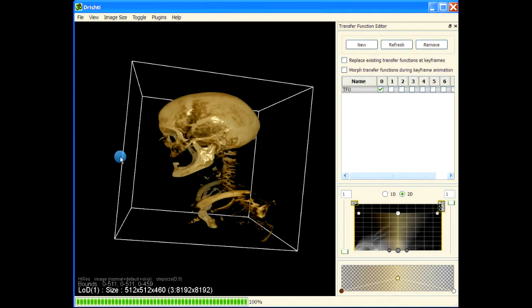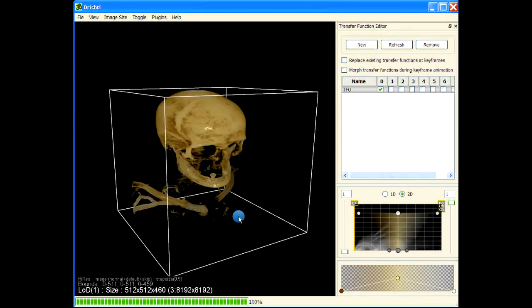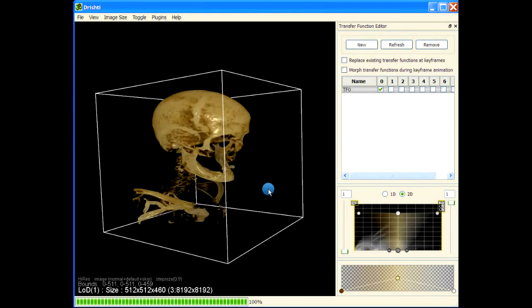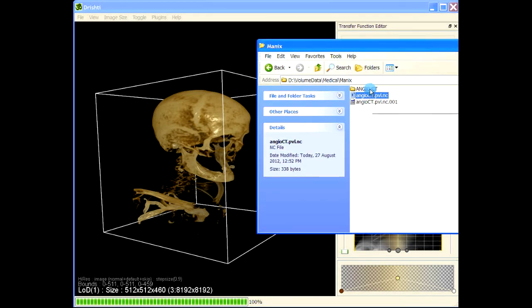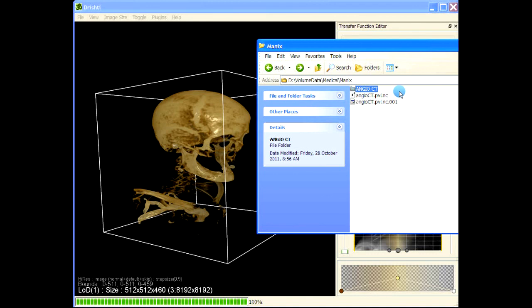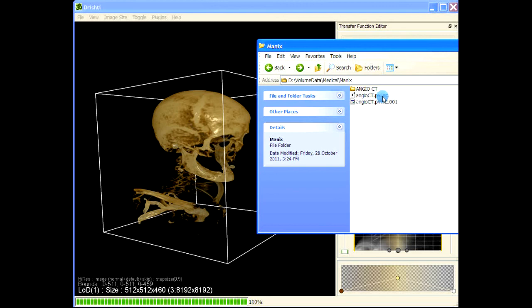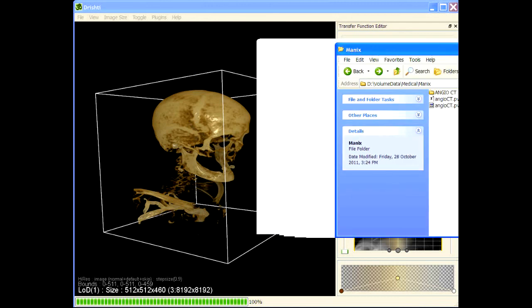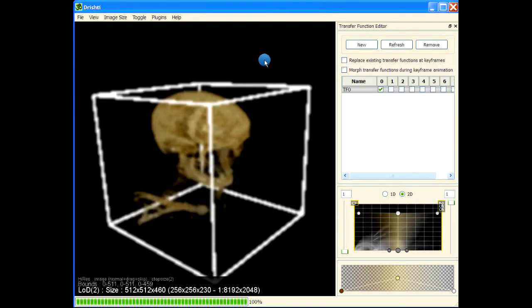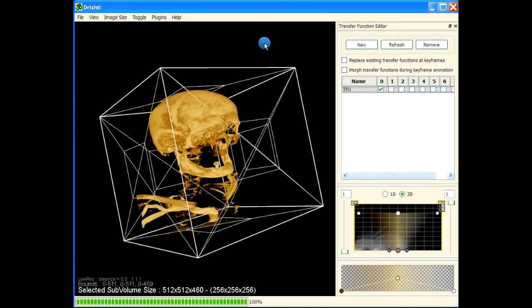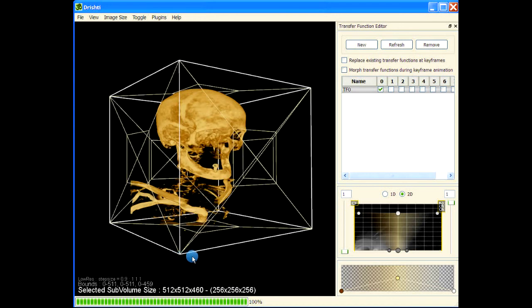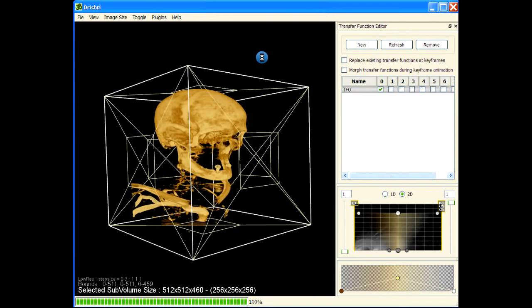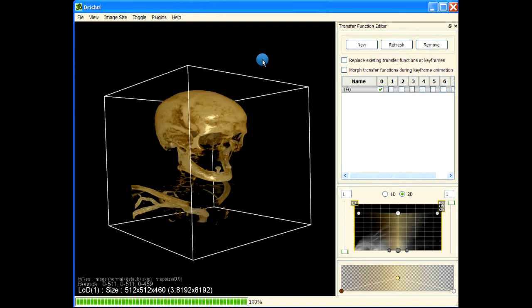So this is one of the most basic workings in Drishti. We have imported this CT data into the importer and then saved the imported data as a pvl.nc file. Then we have loaded this pvl.nc file into the render to view the data. We used F2 to go from low res mode to high res mode - so F2 is a toggle. This video just shows the basic workings to import the data and then to render it.